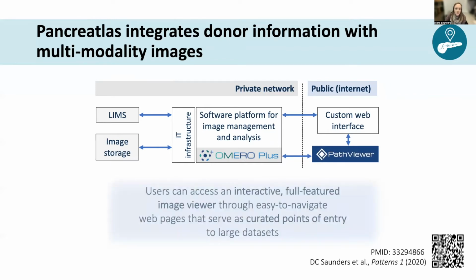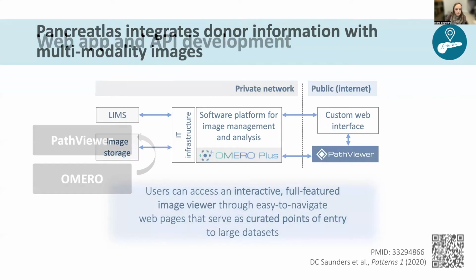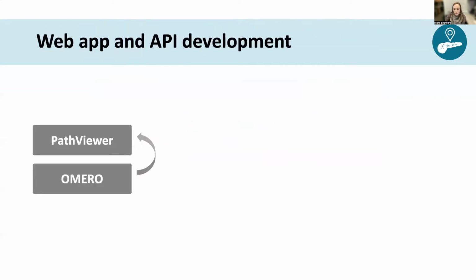What this allowed was that our users could interact and access these fully featured components of the Omero system, but also have easy curated points of entry to start exploring. If any of you have used the OME web browser, you know there's a bit of a learning curve to access relevant image and study metadata. So our goal was to leverage the platform's features and put them in the hands of a more casual user with as little friction as possible.